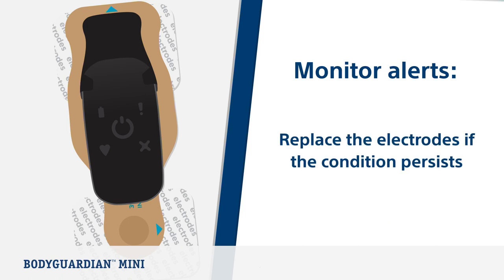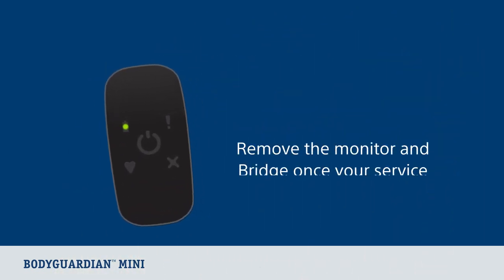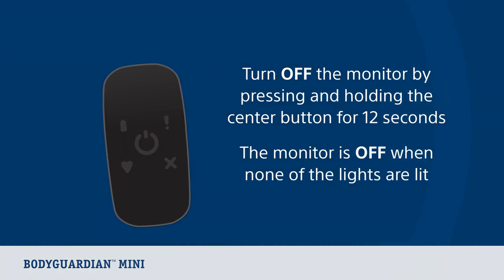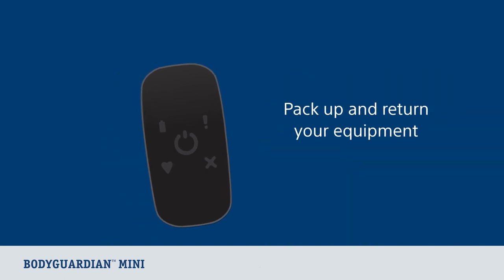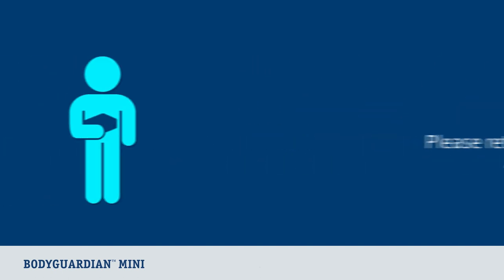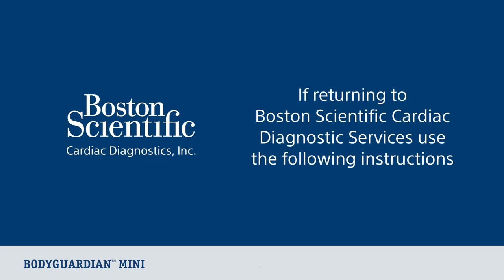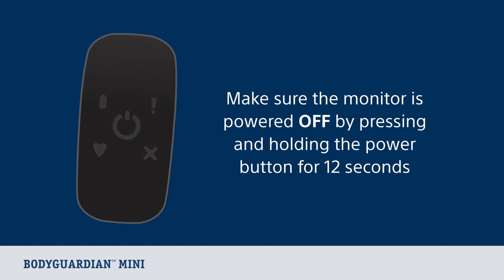Now let's look at what to do when the study concludes. Remove the BodyGuardian Mini Monitor and Bridge as soon as your physician or qualified healthcare professional ends your service. You will need to turn off the monitor by pressing and holding the center button for 12 seconds. You will know the monitor is off when none of the lights are lit. Now you can pack up and return your equipment. Make sure the monitor is powered off by pressing and holding the center button for 12 seconds.